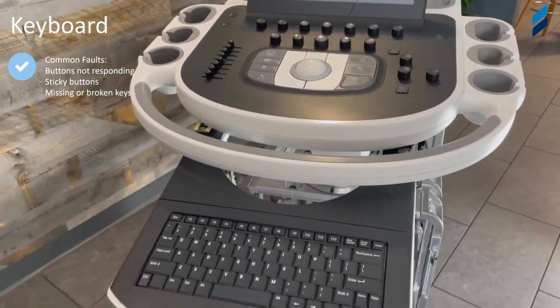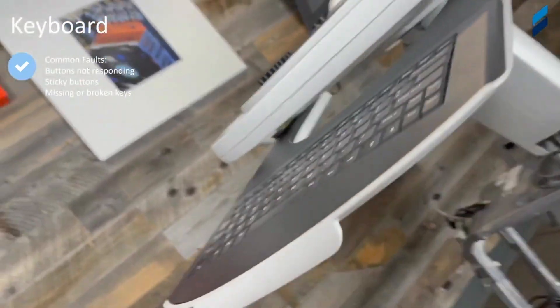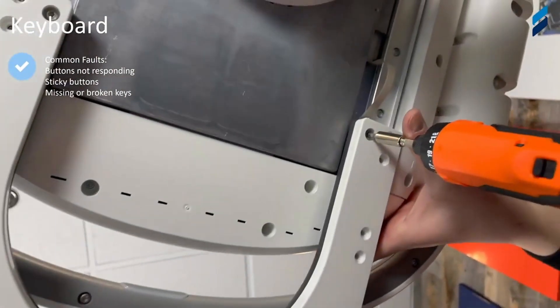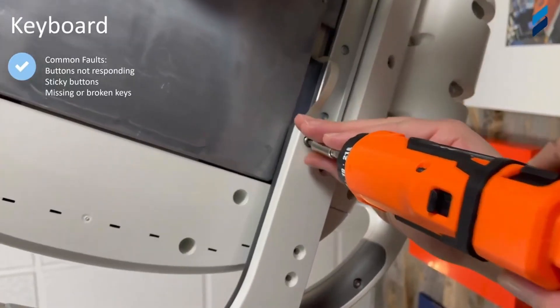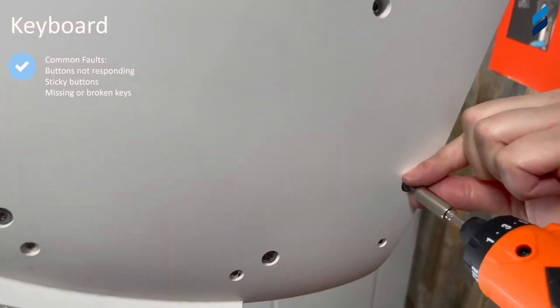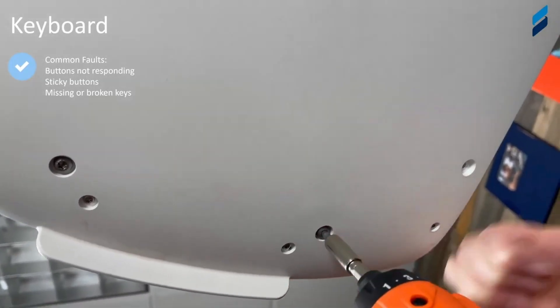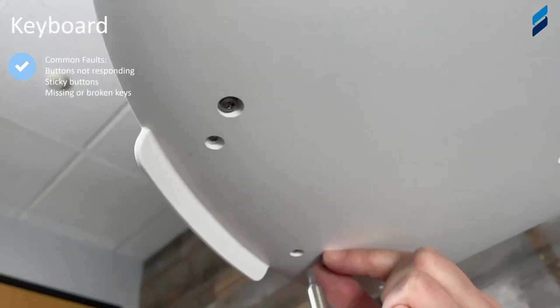We have the keyboard here — this is the QWERTY keyboard with all the alphanumeric characters that a sonographer would use to enter information into the machine. It slides out. Typically when these are failing, you'll see sticky buttons, buttons not responding, or with rough usage some keys are actually missing — we've seen that fairly often. We're going to go underneath where the rails are and take all the screws out underneath.